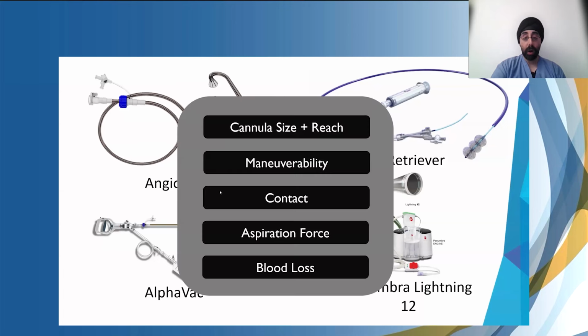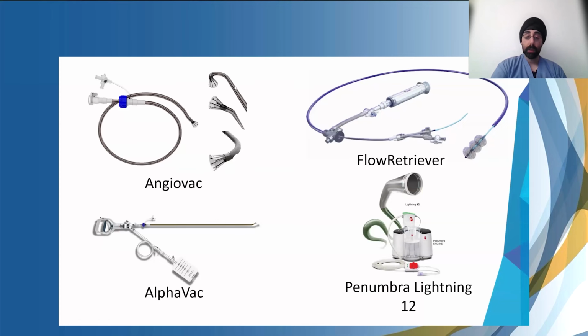I don't know if you guys have more comments than that. I like the continuous flow aspiration in these, so I tend to use AngioVac for most of them just to lower the embolic risk. I tend to approach these vegetations with the flow on and ramp up until I debulk most of the vegetation.